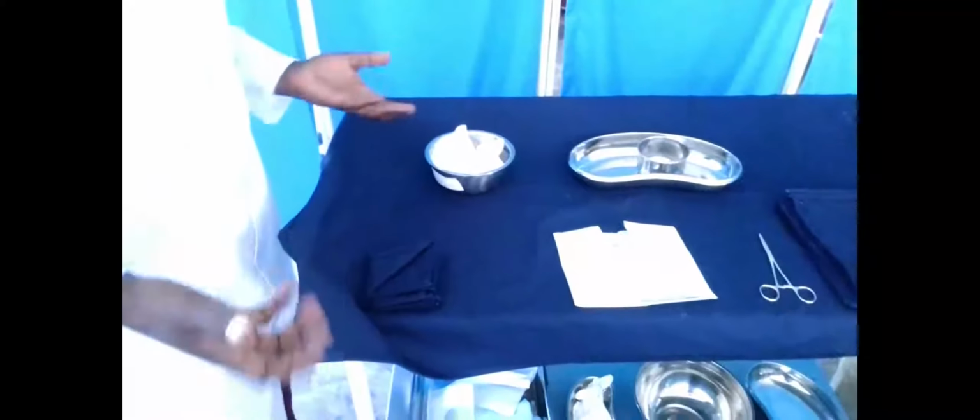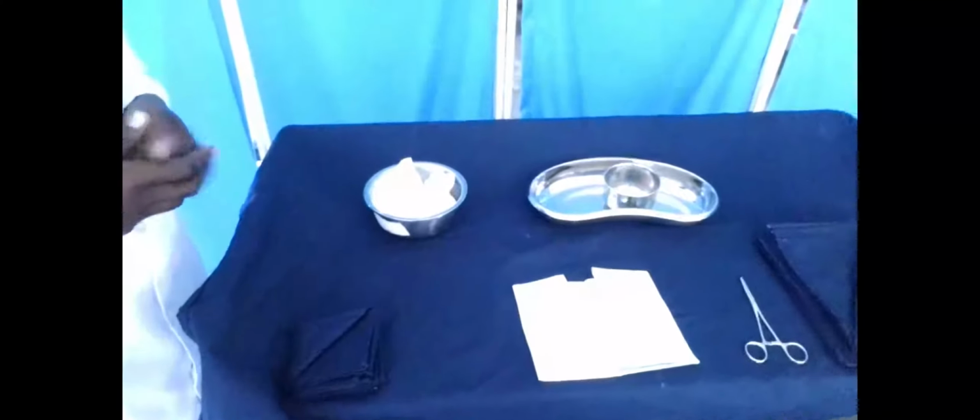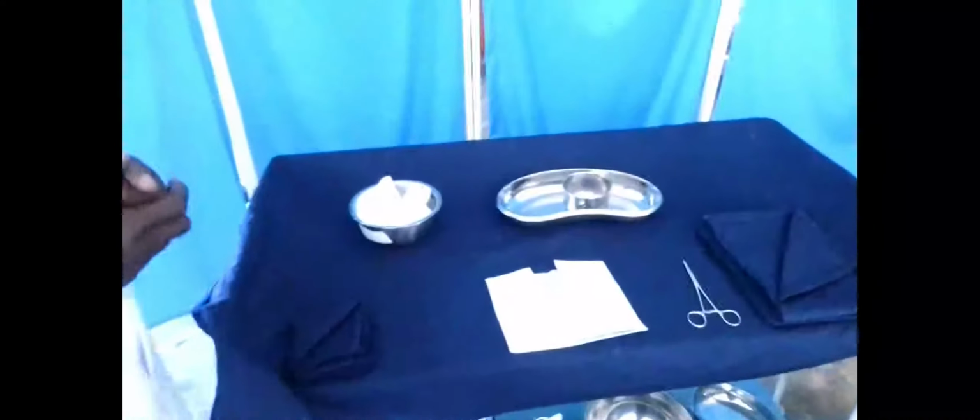So now let's introduce the trolley. We've got the top shelf and the bottom shelf. We start with the top shelf. On the top shelf, we've got a hand drying flannel or drape. You can call it a flannel or towel or drape. Then we've got a ball of gauze and cotton balls. These balls will be used for cleaning. Then we've got a pair of sterile gloves.